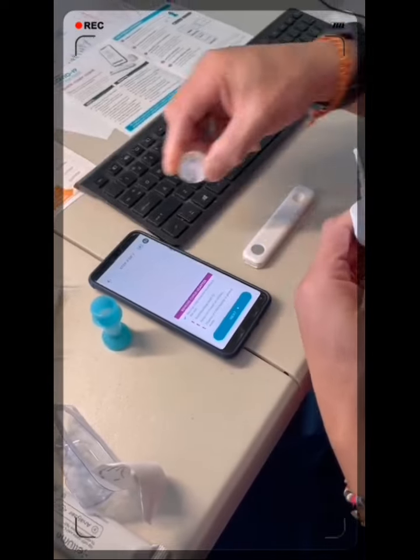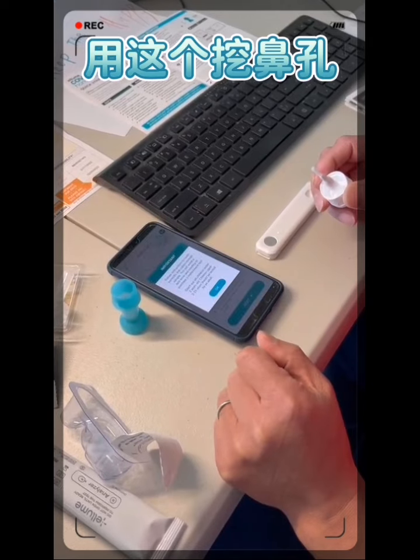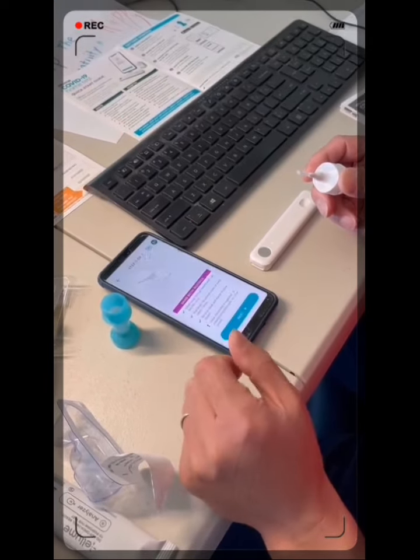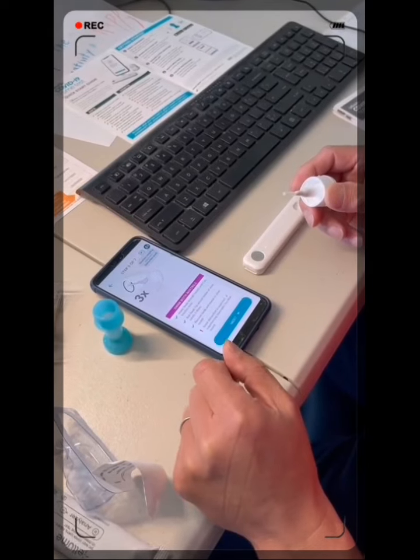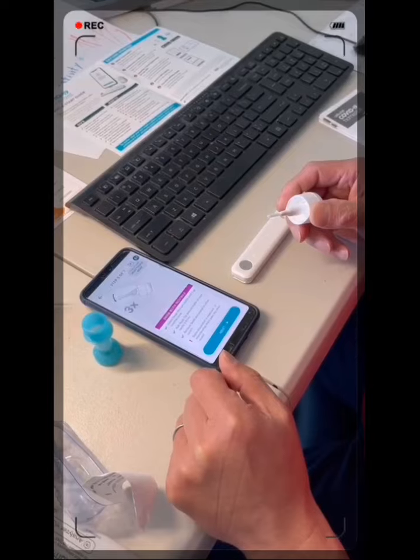Children adapter — remove. Next, hold the nozzle. Insert swab through nostril until the cap touches the nose. Rub, remove swab, and repeat for the other nostril.